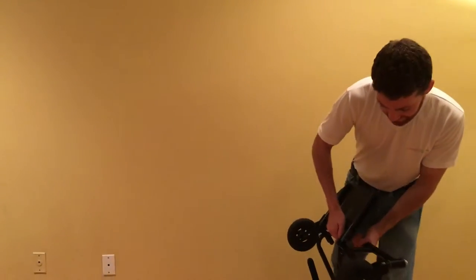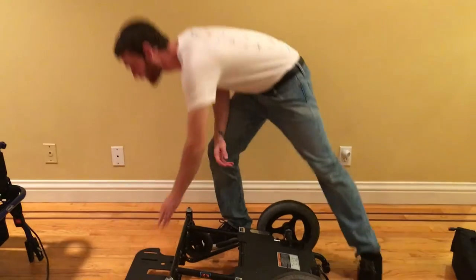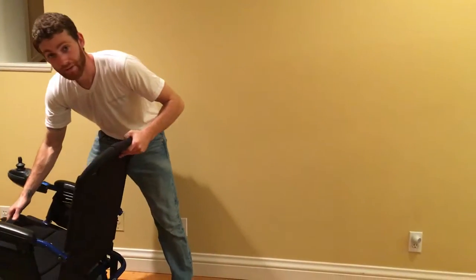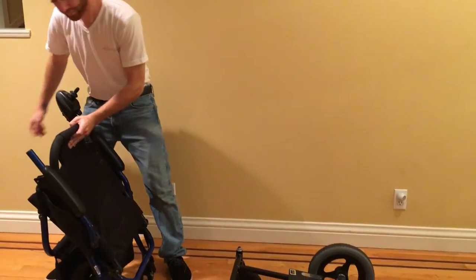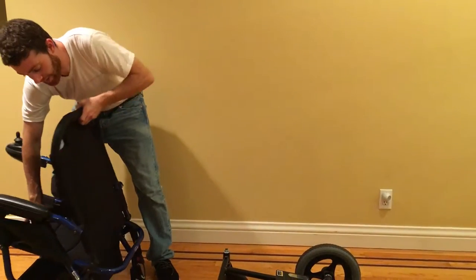Can you show us also how to assemble it back together? Definitely! So this chair actually folds up just like a lawn chair — it's very convenient. So we'll fold that back out.